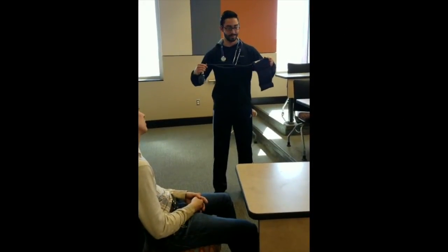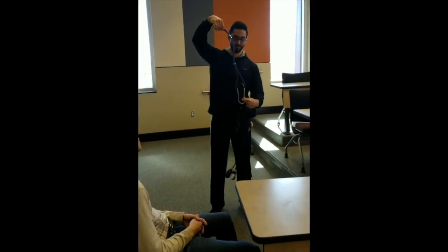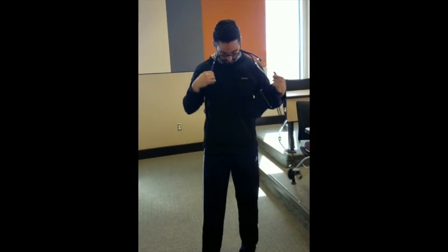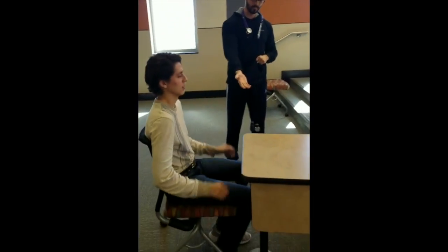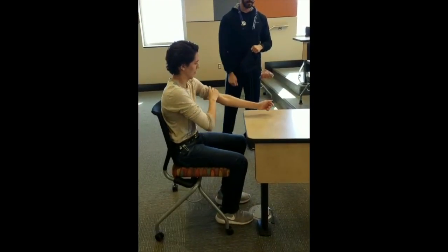In order to measure resting blood pressure, a blood cuff, manometer, and stethoscope are required. The subject must be seated straight with their back against the chair, arms extended facing upward to expose their brachial artery, and their feet flat on the ground.